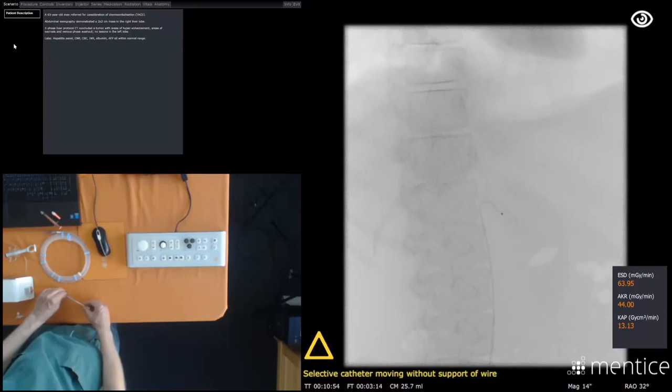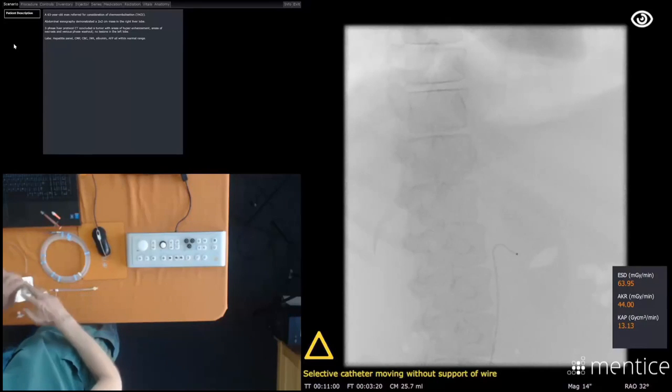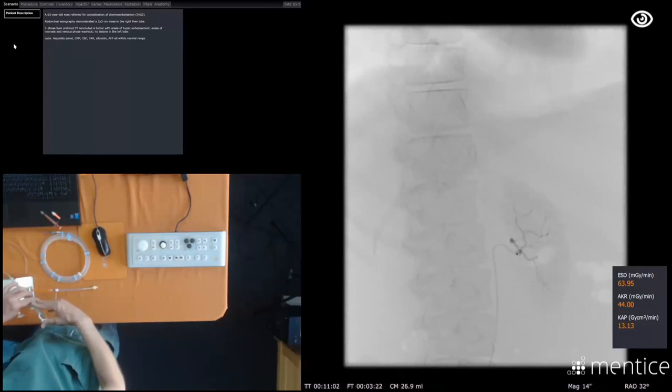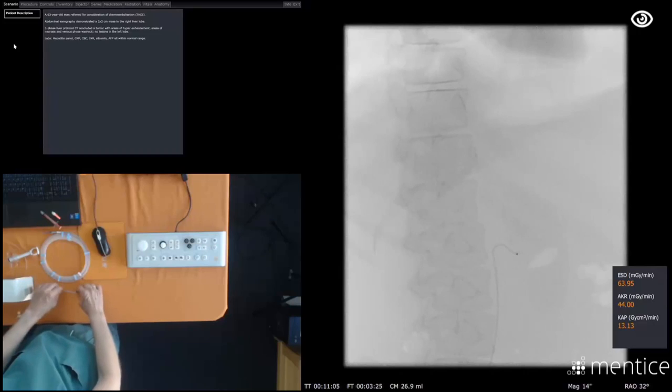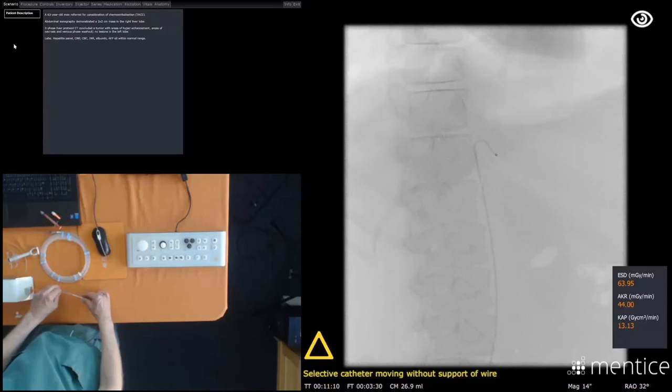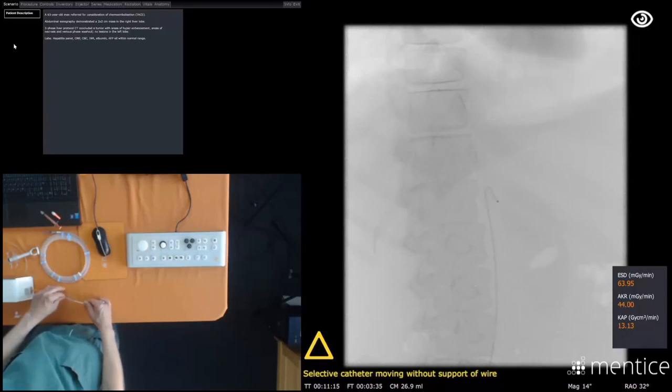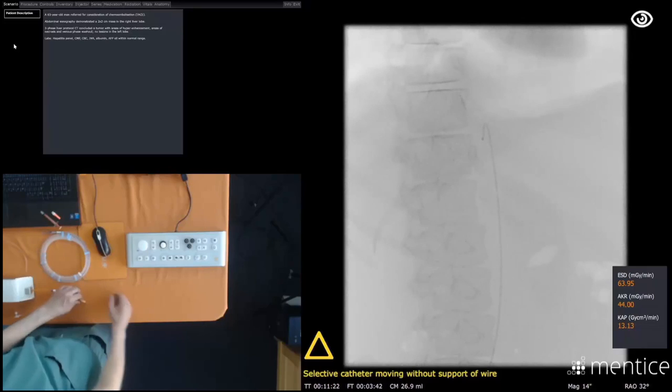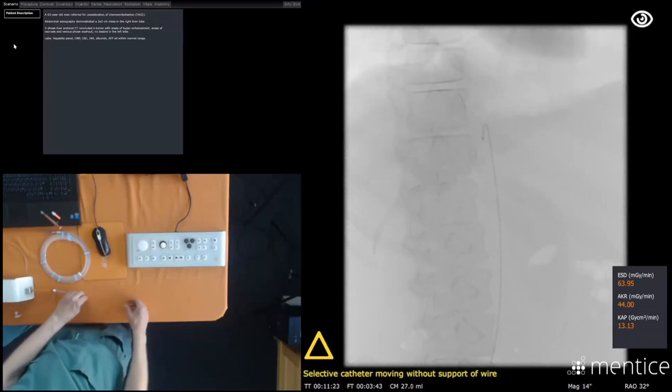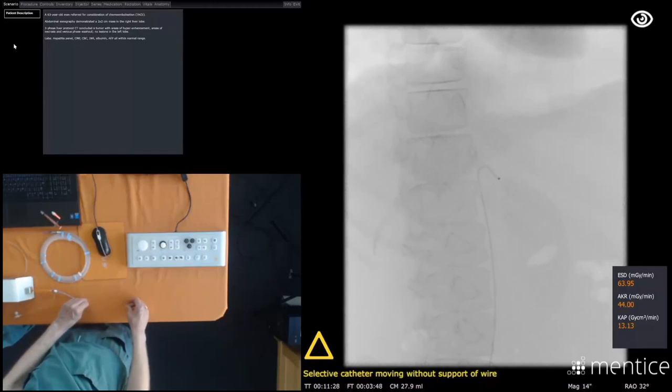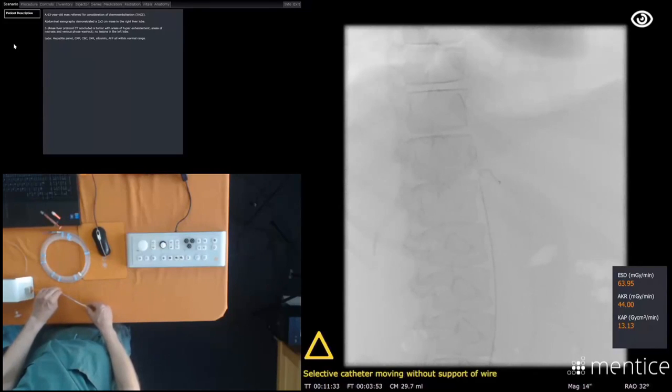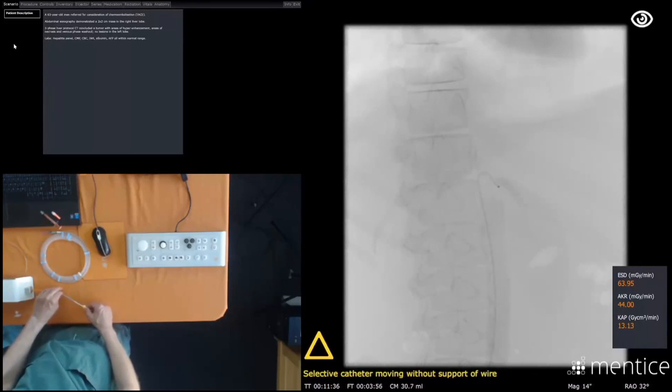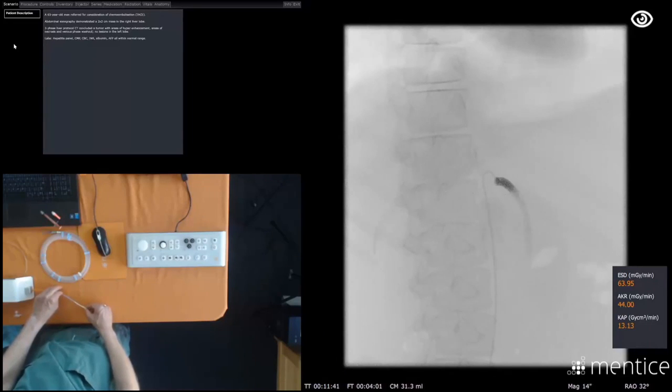This is causing me from time to time some problems, so I'd like to go a little bit like this to find a better solution to find a way in. If you go too low, you'll probably get into the renals there. Do you want to see the renals? Of course. Oh, it's not. Well, you are there, so you're too low. You can actually pre-plan your procedure so you can see where you are. Already here you can see I'm getting into some problems. I'll do it like up here to see where we are. Down, down, further down. Here. That looks good. SMA? Yes, yes, yes, very close to the SMA. You might need the guidewire to get out there. There you go.